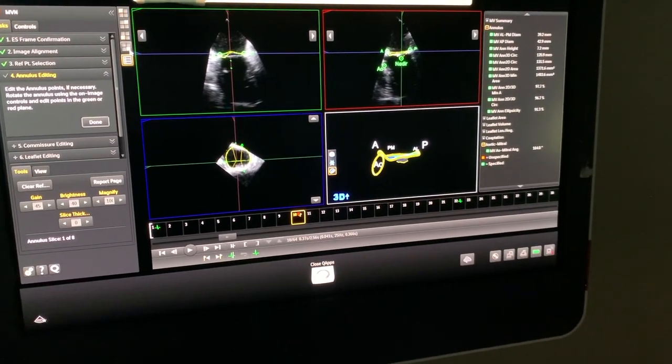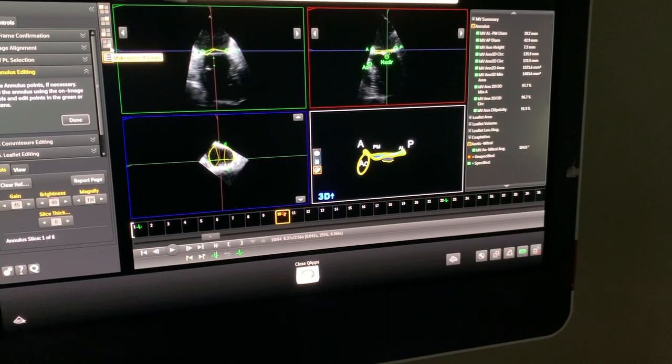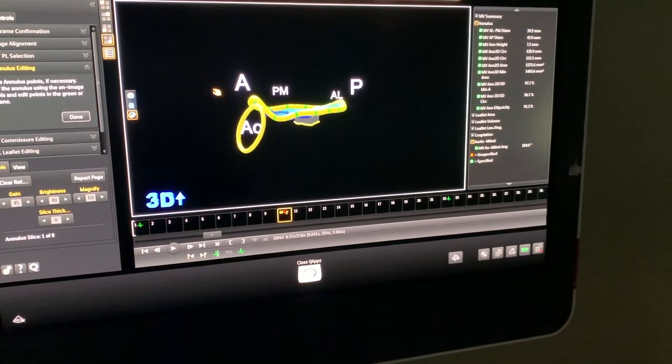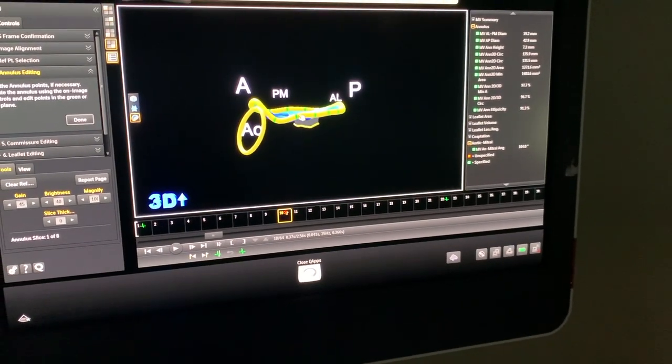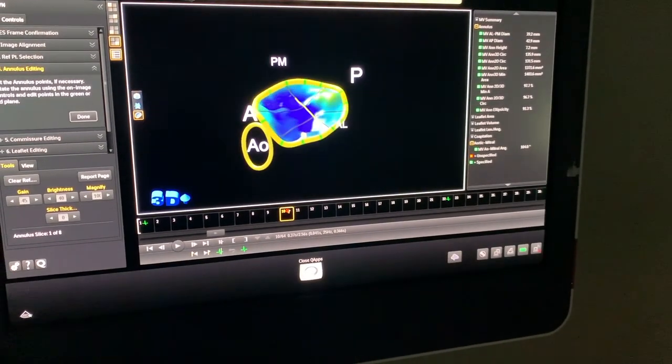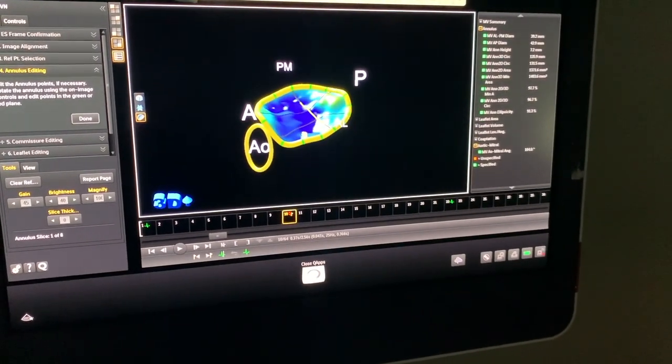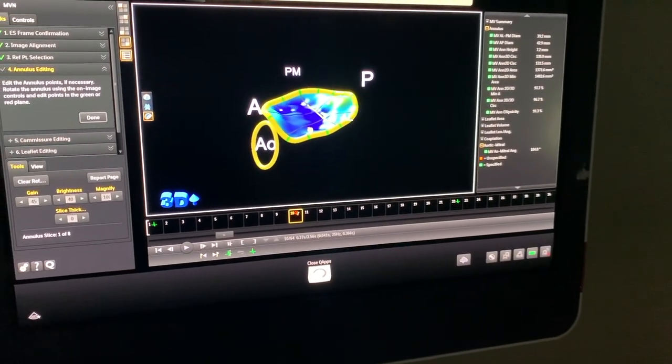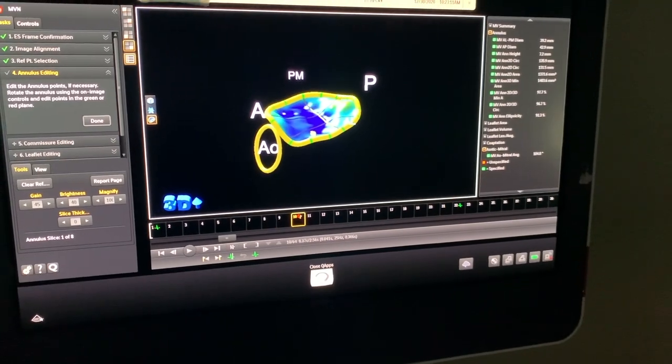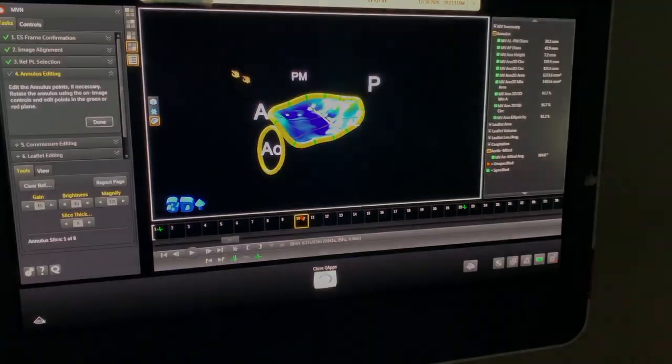So as you can see, it's pretty simple — one, two, three — you have your aorta-mitral angle calculated for the surgeons.